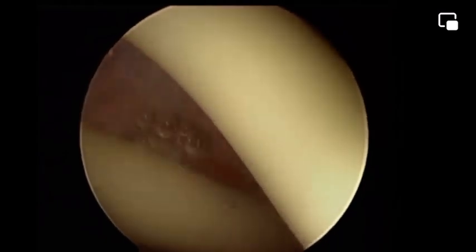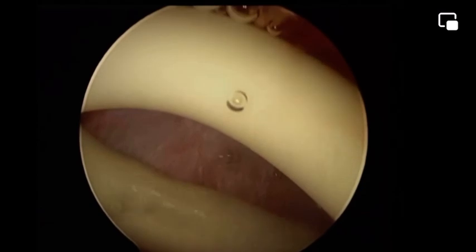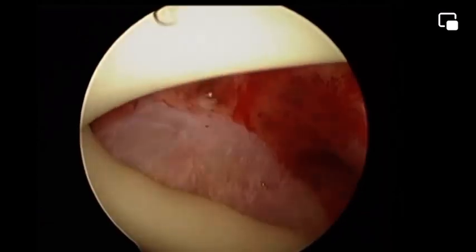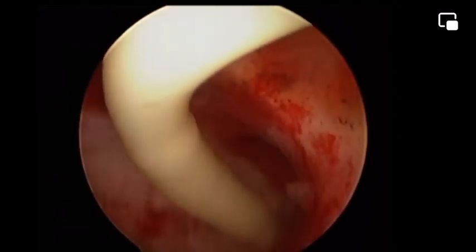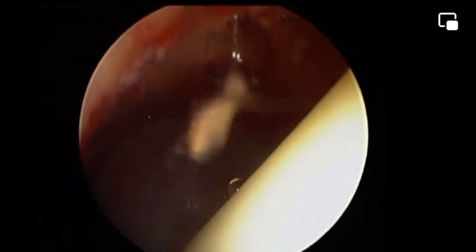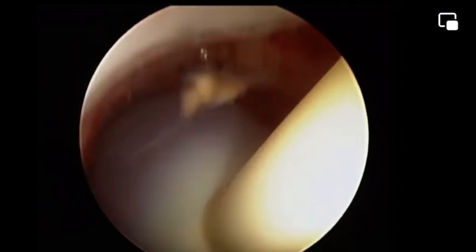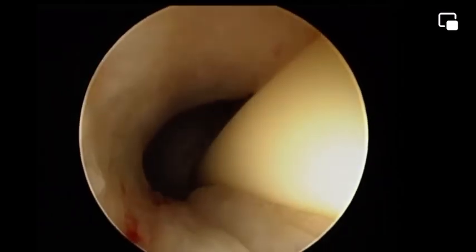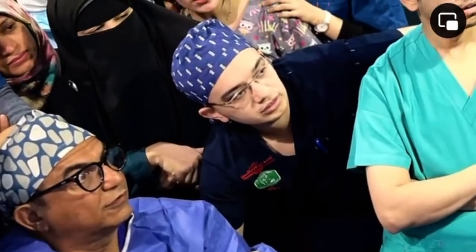There are so many ways, like using an intrauterine device or gels or membranes, but I find that the Foley balloon is the optimum physical barrier, and I prefer to inflate the balloon under vision. This will help you know how many milliliters to inflate. It's difficult to estimate that blindly because if you put too much, it will be very painful. If you put too little, it will fall down.